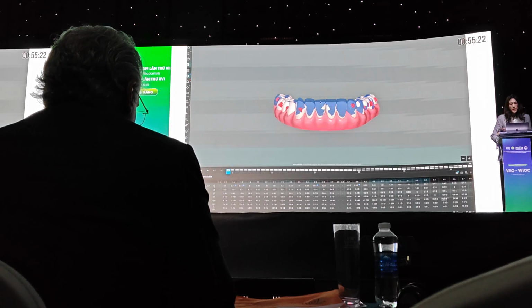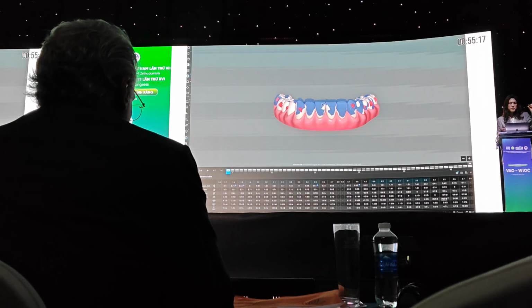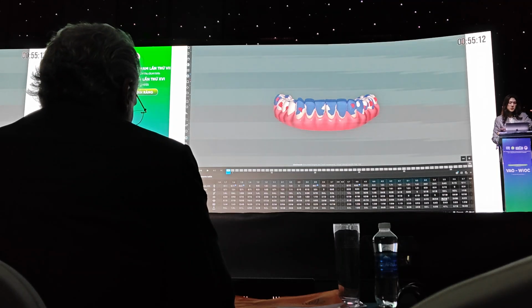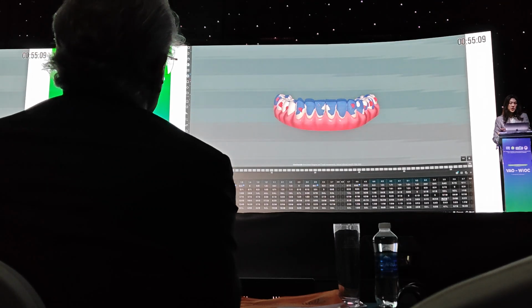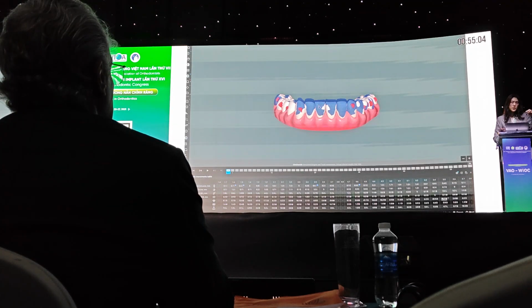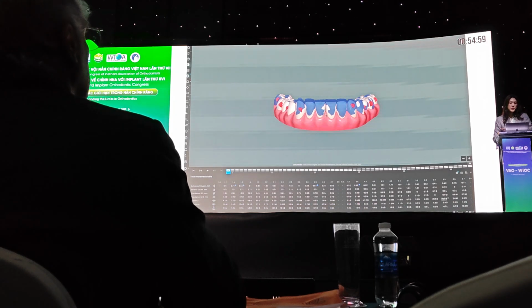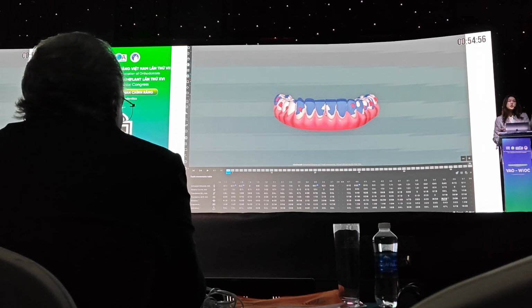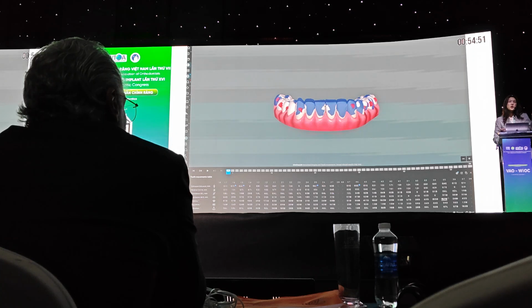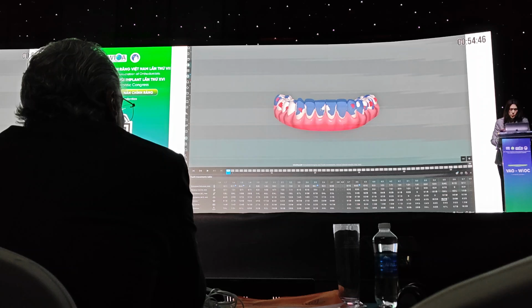So they realized that for teeth that have a very small amount of changes required, they increase the force. So in the ClinCheck, they over-engineer intrusion of these teeth with small amounts of changes. So that's internal ClinCheck, I guess. So it's not ClinCheck, internal software. So they calibrated the intrusion force that these teeth will receive, enough amount for intrusion to happen. So that's what it's all about.